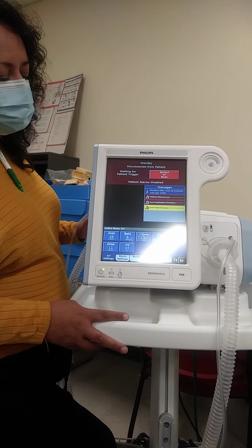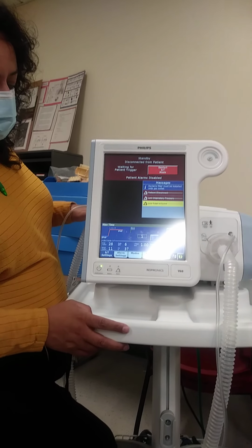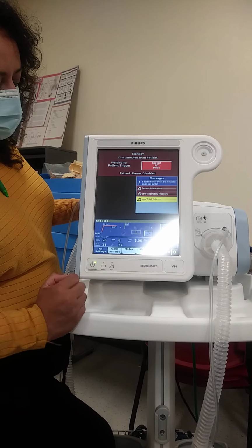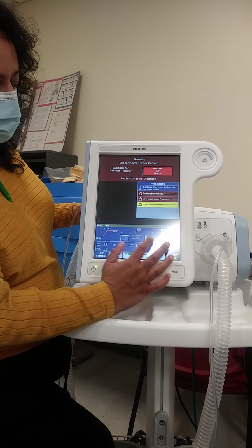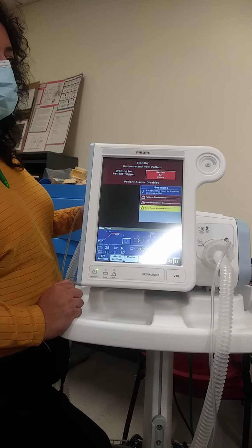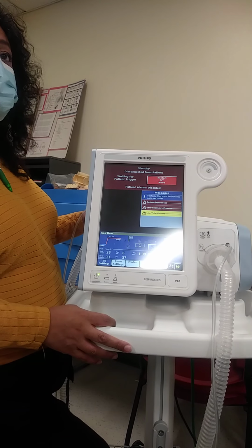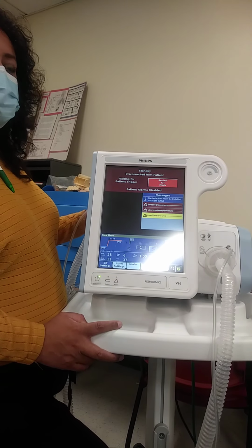Okay. Your rise is basically this pressure going up to your BiPAP, okay? So what do you guys notice about the setting? It's only 1 to 5: 1, 2, 3, 4, 5. The curve, the slope, goes steeper, right? So 1 is the fastest and 5 is the slowest. So 1 is like going up a hill, right?